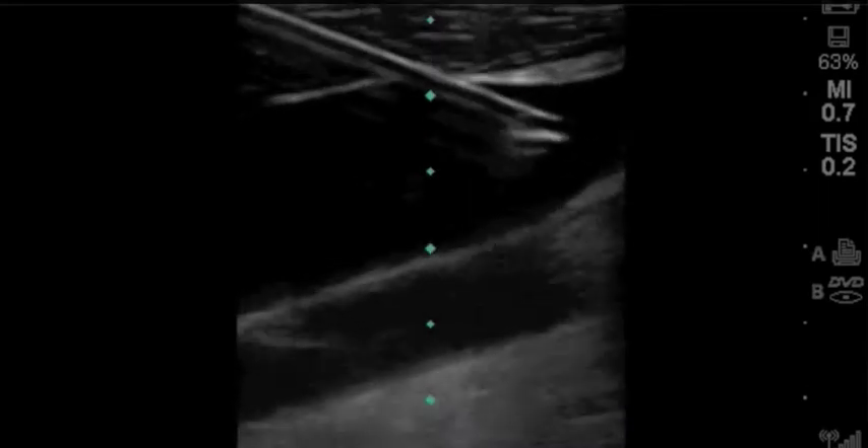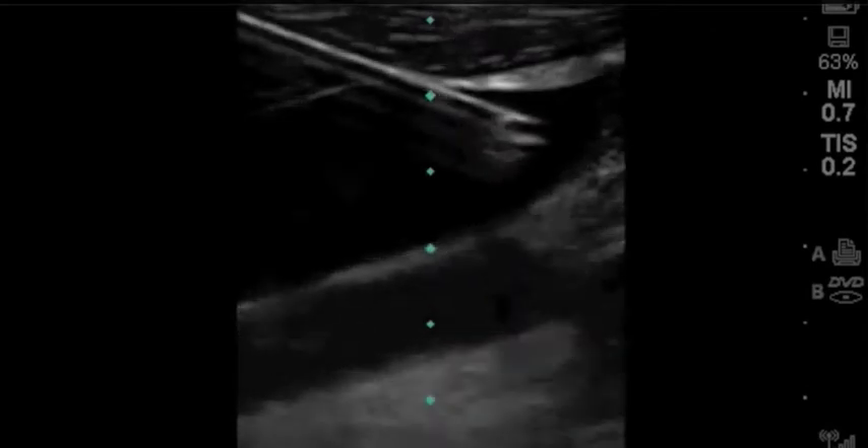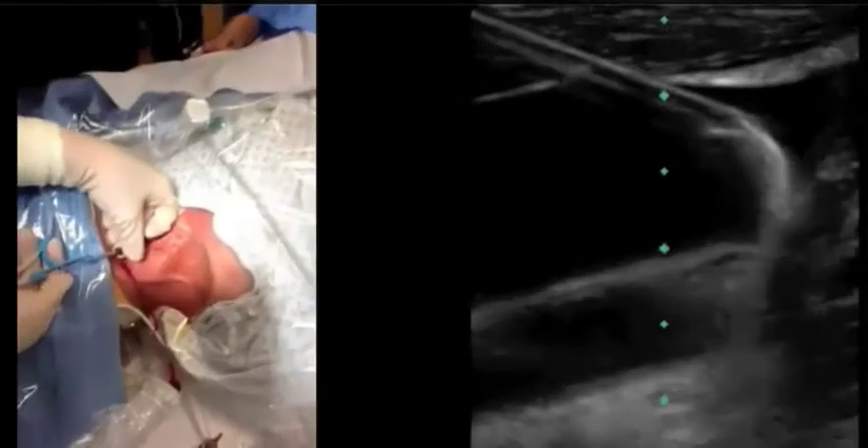In this long axis view, you can also easily see the wire sliding into the vein, and you know exactly where it is as you insert it through the needle. Both the short and long axis approaches are acceptable. At least one randomized study showed the short axis approach to have higher first pass success rates at 98% versus 78%.